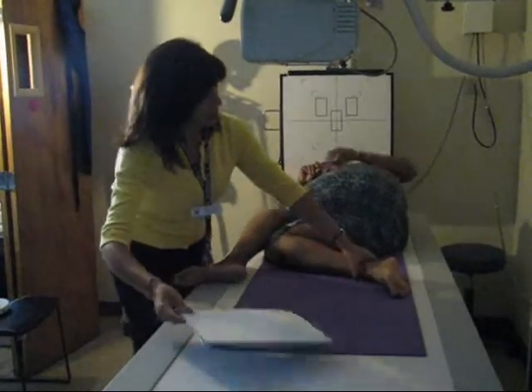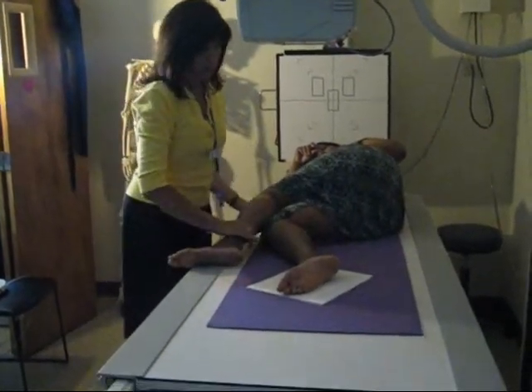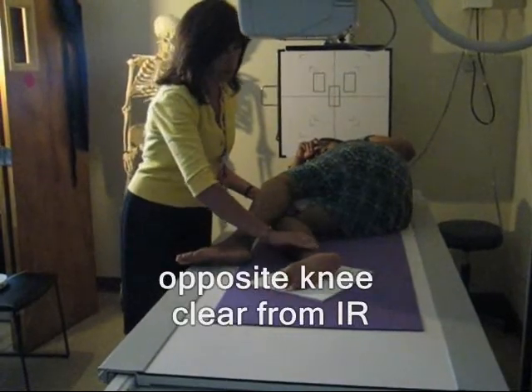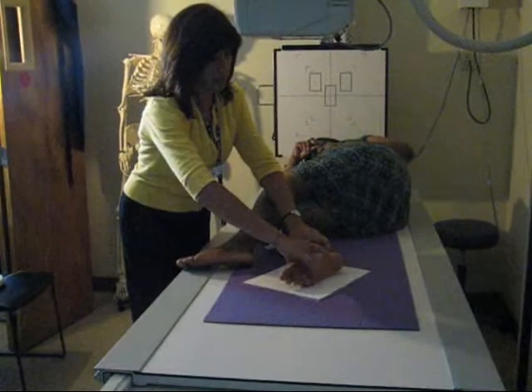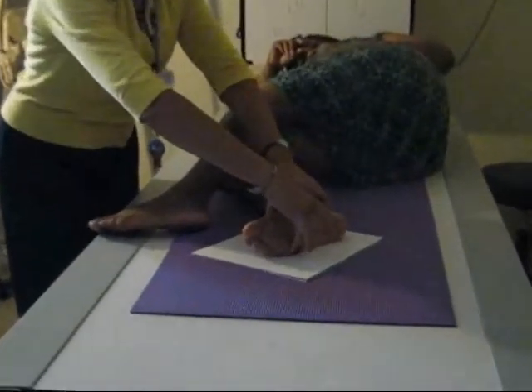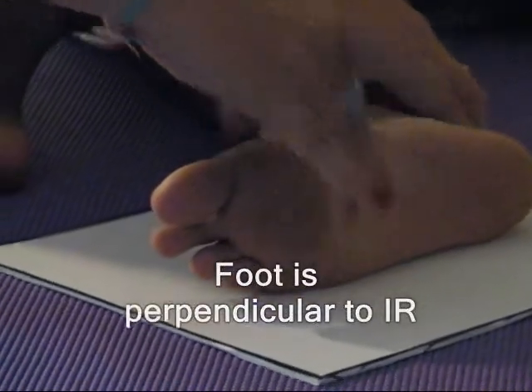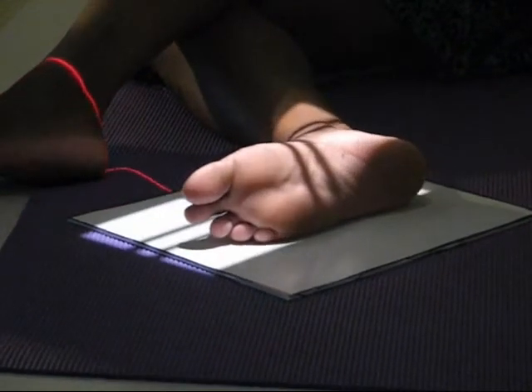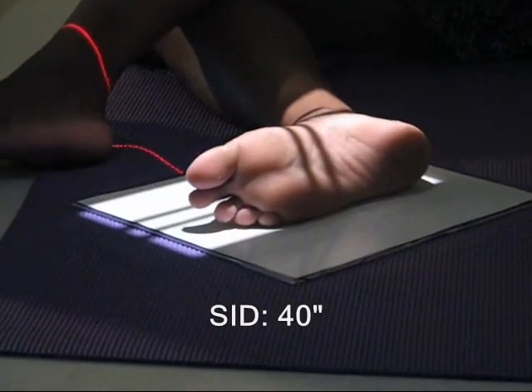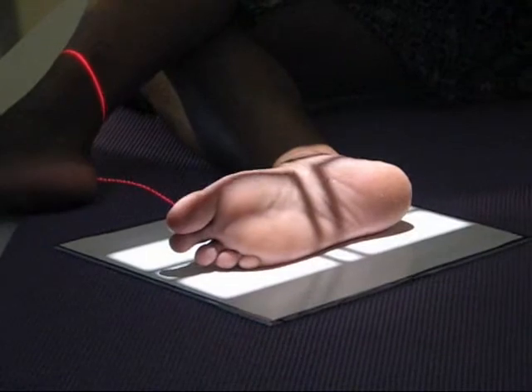We're going to make sure their foot is completely perpendicular, at a 90-degree angle. You may have to rotate your tube in order to make an aesthetically pleasing radiograph.